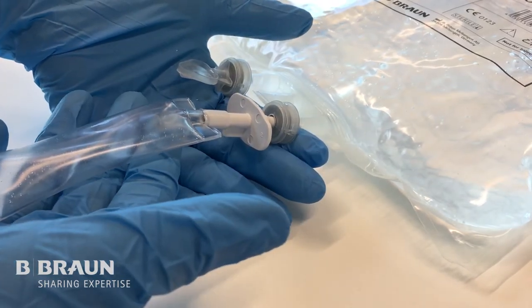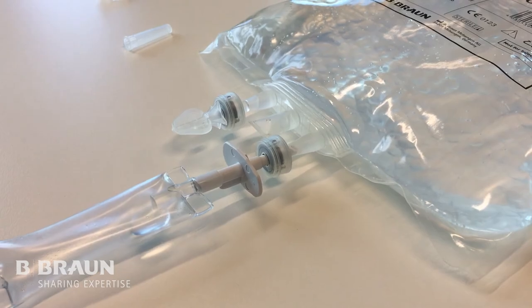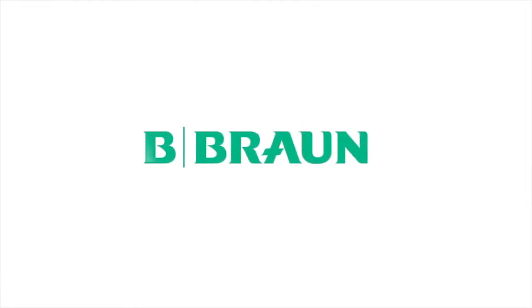Now you are ready to deliver the fluids from the B. Braun Eco Bag.